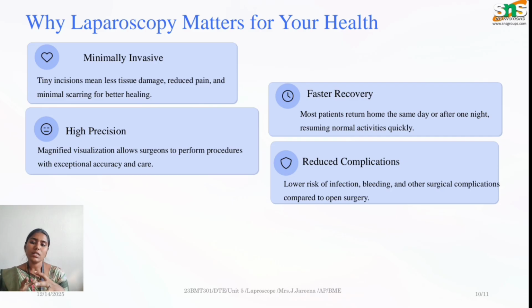So how does laparoscopy help, and what is the benefit of this laparoscope? It is minimally invasive, unlike the endoscope, which is not at all invasive, because without making any cut we send it through a natural opening, through the mouth or nose.